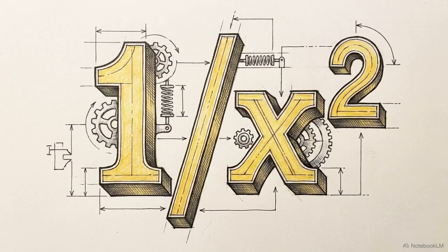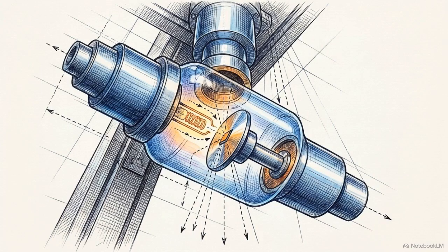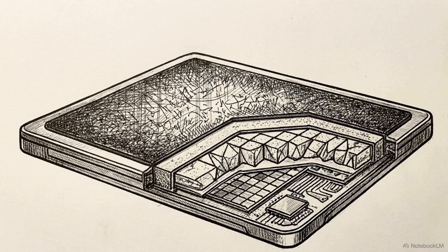This drop-off is not an estimate. It is governed by a rigid law of physics known as the inverse square law. Figure 12-3 proves intensity is inversely proportional to the square of distance. Doubling distance from D1 to D2 forces the same photons to cover an area 4 times as large. Consequently, radiation intensity in any square becomes exactly 1/4 the original. Distance is a highly destructive variable. If you move a tube further from a patient without compensating, you will completely starve the image receptor of the radiation it needs to form an image.